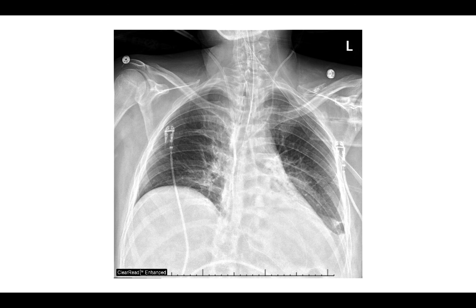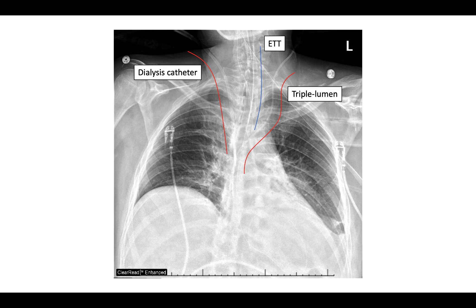This chest x-ray demonstrates multiple lines and tubes. It depicts an endotracheal tube, a dialysis catheter (Mahurkar) in the right internal jugular, a triple lumen catheter in the left internal jugular, and an orogastric tube in the stomach. Note that the dialysis catheter is visibly wider than the triple lumen.